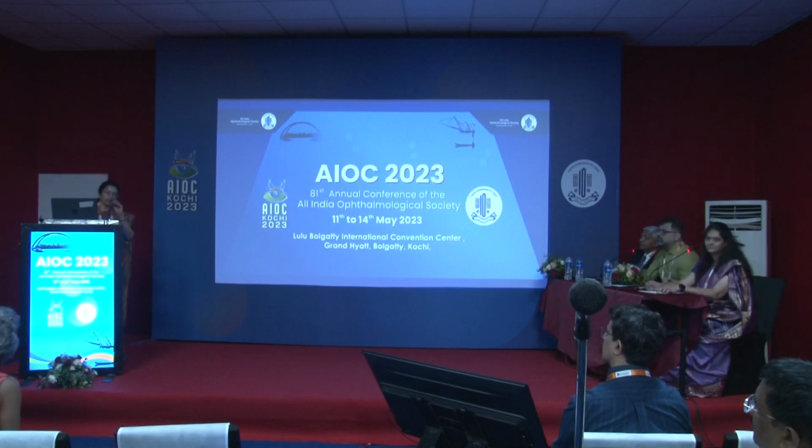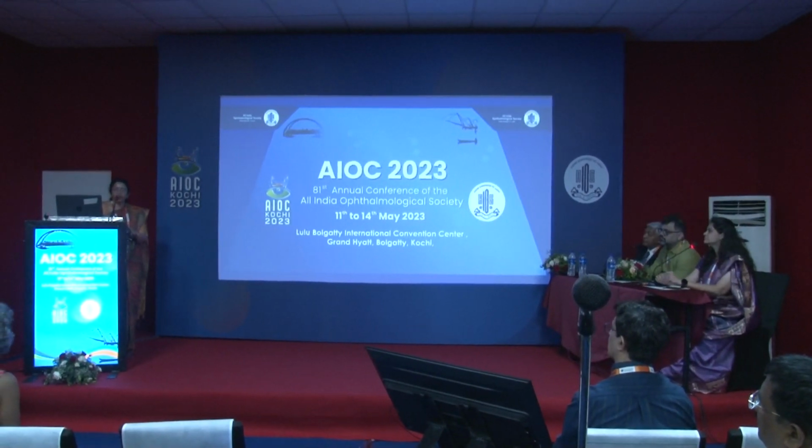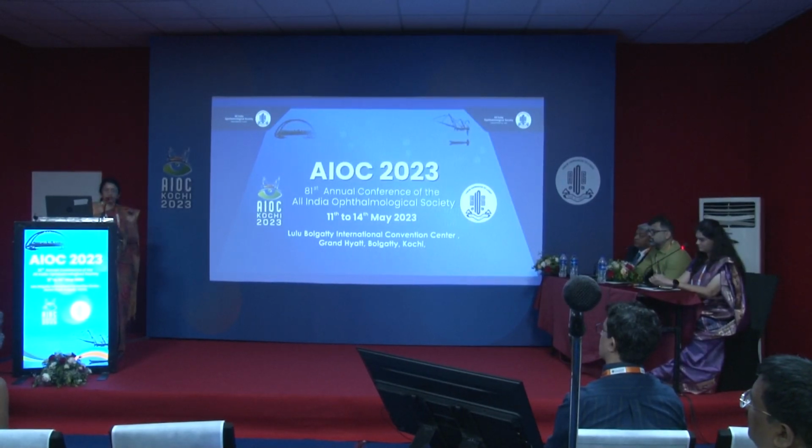Yeah, the Kane formula is available online. Actually, it's an upcoming formula. Newer studies have shown that it is very accurate. Basically it's a theoretical formula, but it uses artificial intelligence also. It takes into account the axial length, keratometry, ACD, and also the gender of the patient, and then it has some artificial intelligence algorithm also. It's available only online. As far as I know, it's not available in any of the biometers.